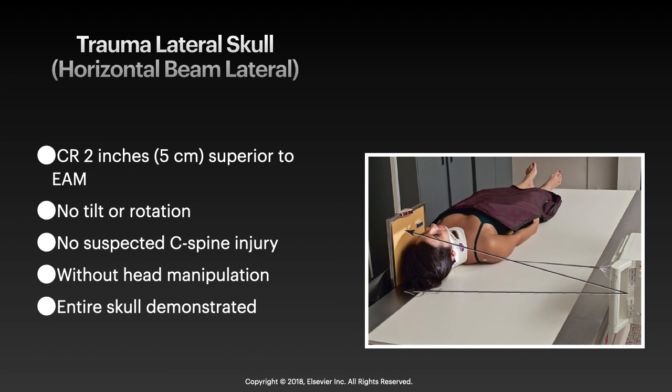Trauma lateral skull, CR is 2 inches superior to the EAM. No tilt or rotation, no suspected C-spine injury, and without head manipulation.